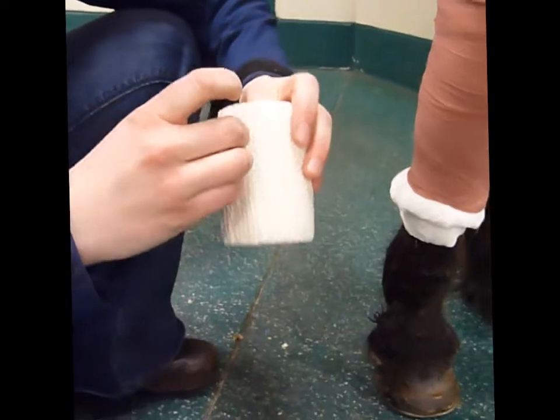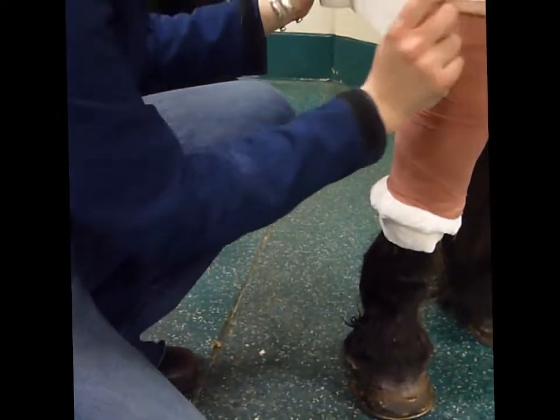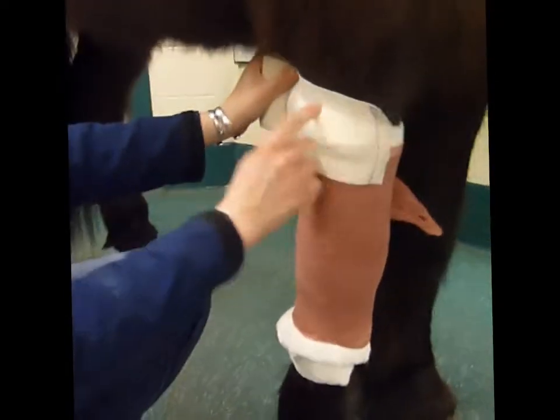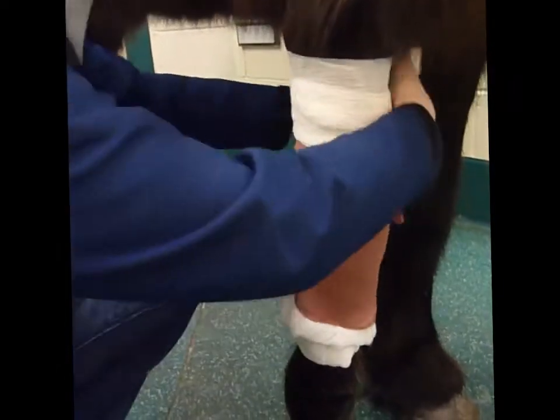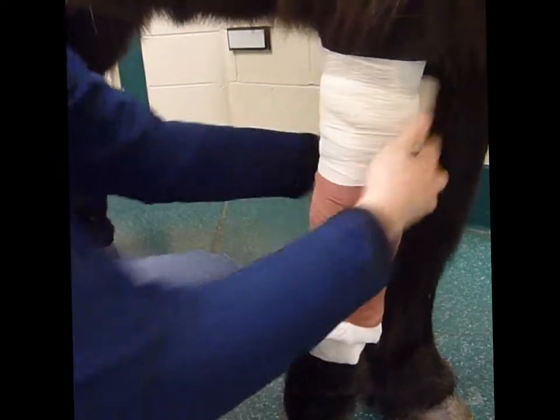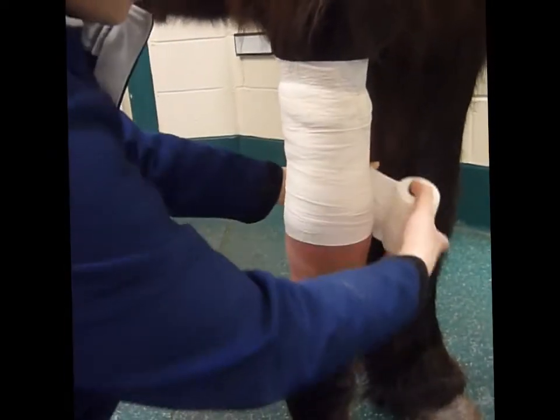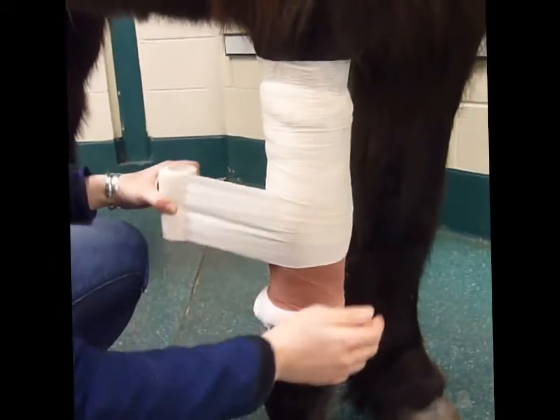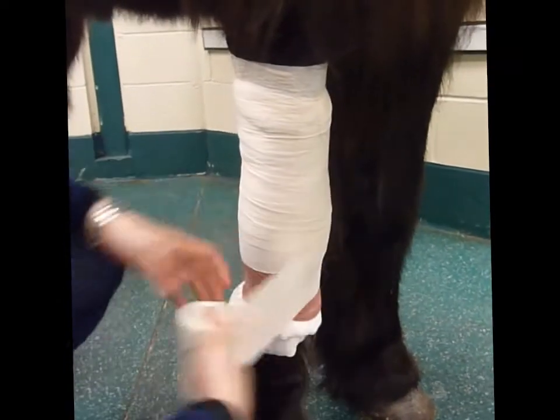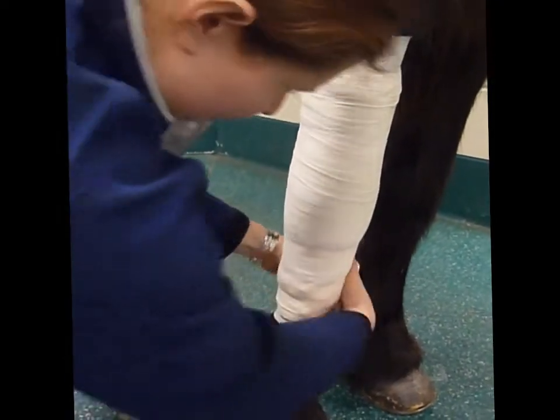This is the expand-over. The blue line is the end of it, and the inside is sticky — so sticky side down. Go start a bit over the top. Stick it right to his hair there. I usually try to overlap them about half. Nice and tight? This one you don't want to go quite as tight. I usually tighten it over the front of their knee and then just kind of set it on — you don't want it loose by any means. Just go down to stick it to his skin a little bit at the bottom.